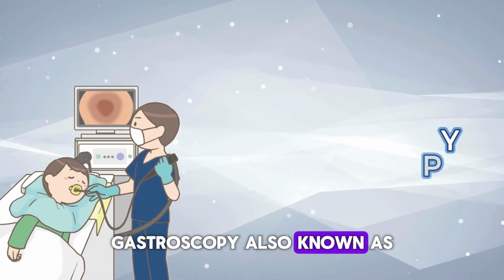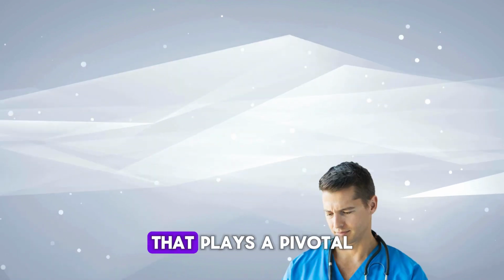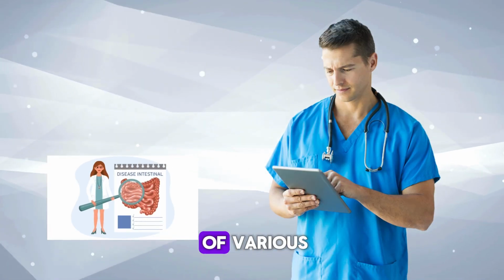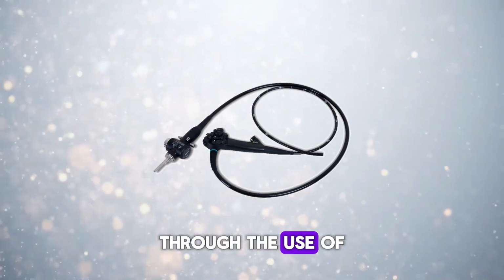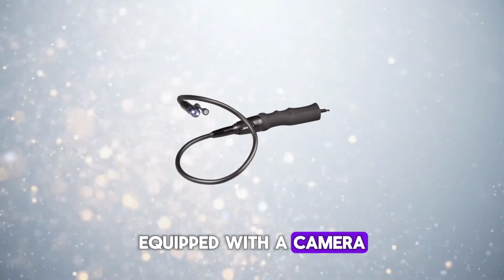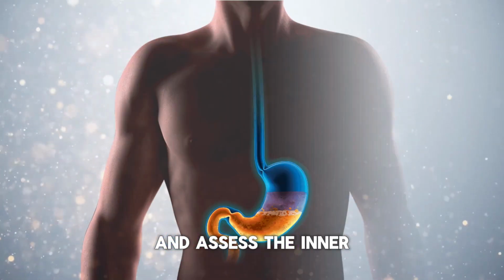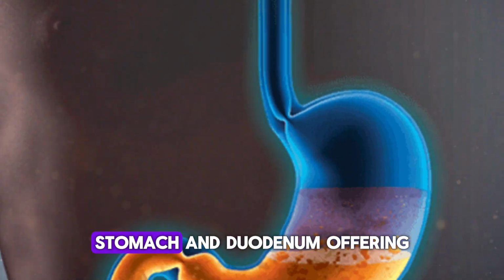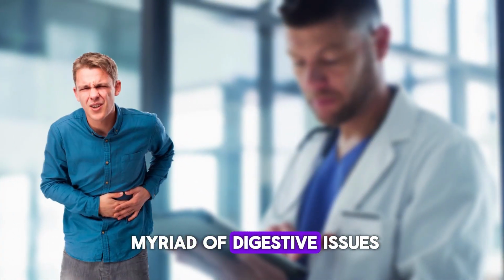Gastroscopy, also known as an upper endoscopy, is a minimally invasive diagnostic procedure that plays a pivotal role in the evaluation of various gastrointestinal, or GI, disorders. Through the use of a flexible tube equipped with a camera and light, gastroscopy allows healthcare providers to visualize and assess the inner lining of the esophagus, stomach, and duodenum, offering valuable insights into a myriad of digestive issues.